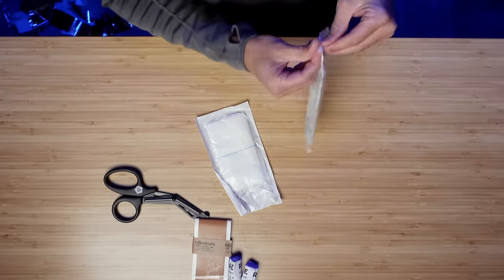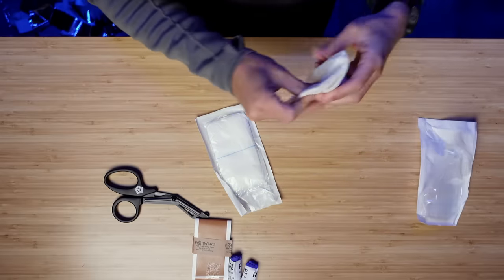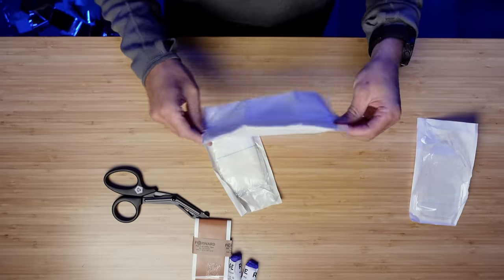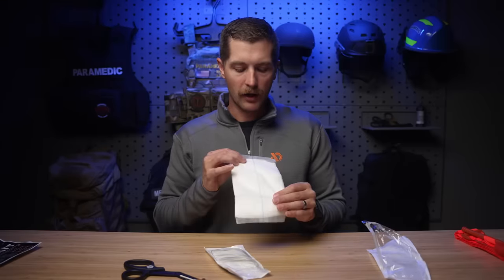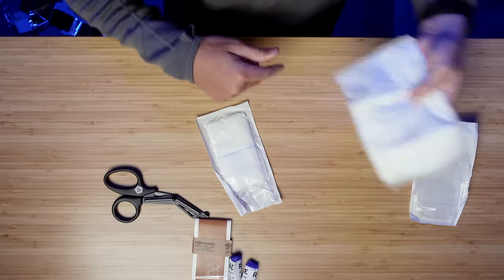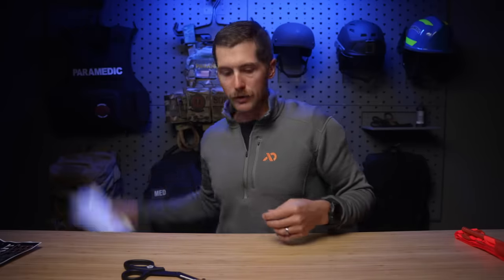Coming down the line, we've got two abdominal pads. These are basically gauze that can be used for minor bandaging. This would be great with the Esmark bandage — you could put this on a minor wound, then wrap the Esmark bandage with it. They've also got a radio-opaque line, so if these were shoved into a wound they can be seen on an x-ray at the hospital. Two of those in there.